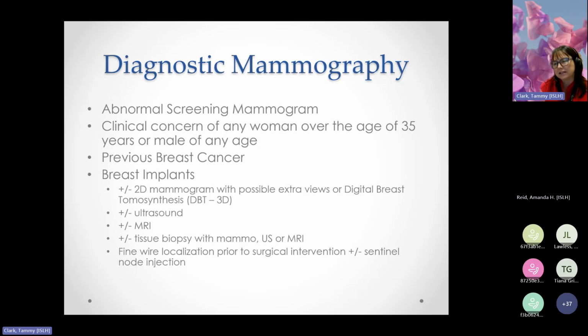So the other people we're getting into diagnostic that don't qualify for screening mammogram are those patients that have had previous breast cancer. So they all need a doctor's requisition every year and to have a mammogram every year. Patients with breast implants also need a doctor's requisition. And again, this is all based on family history. If the patient is with breast implants and they have no family history, we're going to see them every 2 years. If they do have first degree family history, we're going to see them every year. So there's lots of extra things here once we get patients into diagnostic.